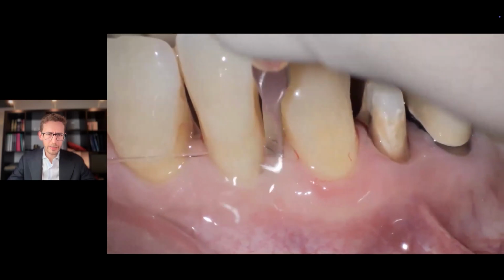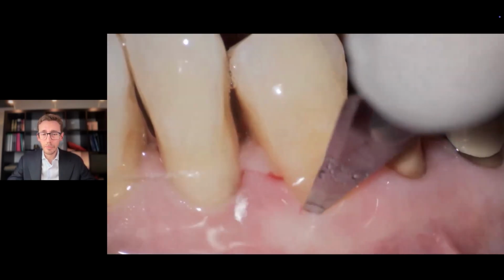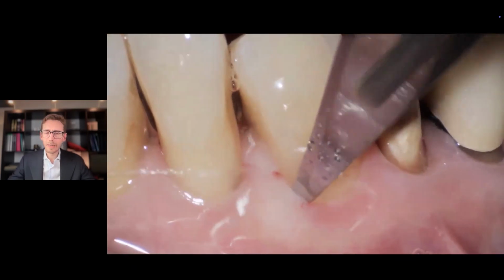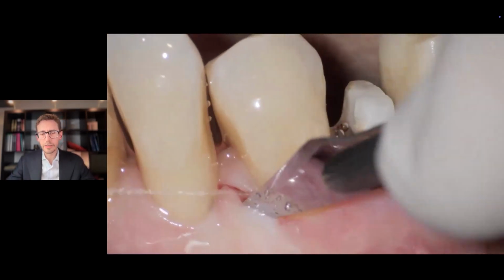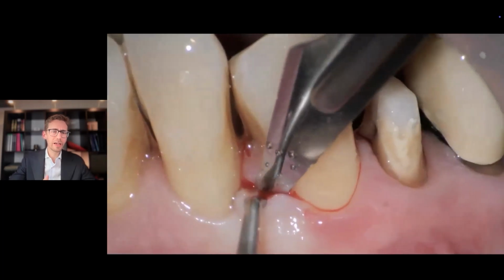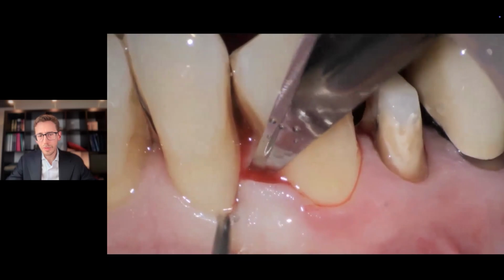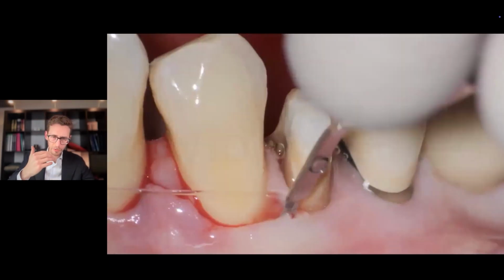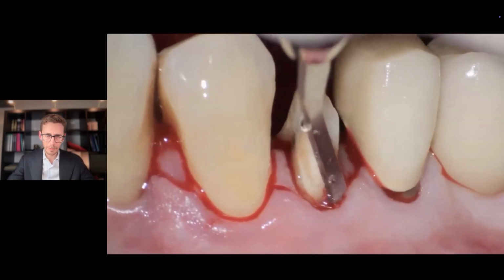The surgical technique in this case was a minimally invasive surgical technique. So according to the modified MIST approach, we are just raising 2 very small buccal flaps with split thickness papillae and minimal full thickness elevation of the buccal flap. In the specific case of tooth number 12, I inverted a little bit the angulation of the incision to improve my capacity to see the palatal component of the defect from the buccal aspect of the surgical field without the need to elevate a palatal papilla.